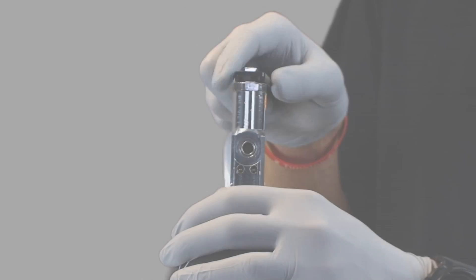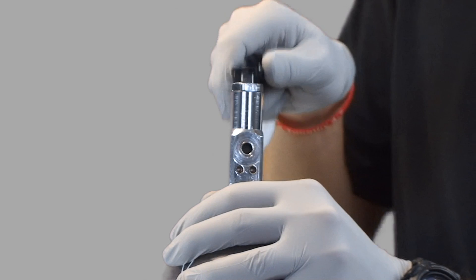Next, I will ensure there is no debris in the oxygen cylinder valve by cracking the tank very briefly. Before I do this, I need to make sure the valve is not facing me, my patient, or any bystanders.